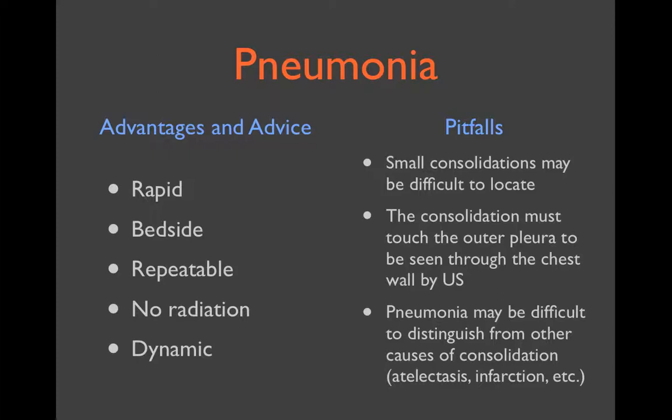One should be aware, however, that there are some aspects of this application that can be difficult. For instance, a small consolidation may be missed in the voluminous thorax. Furthermore, the consolidation must be superficial enough to touch the pleura, since any interposing air would block the ultrasound waves. Finally, pneumonia may be difficult to distinguish from other causes of consolidation, mainly atelectasis, which may be either obstructive or compressive.